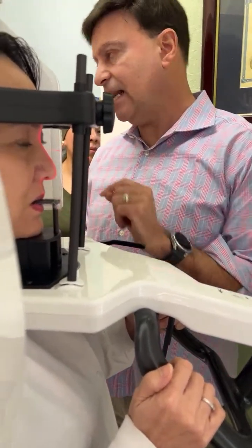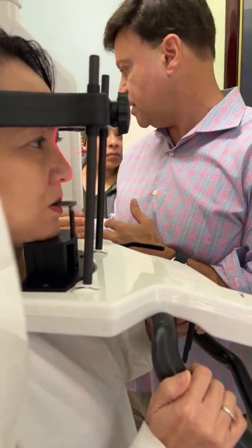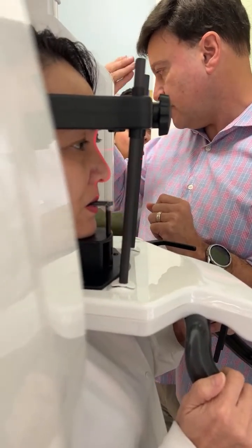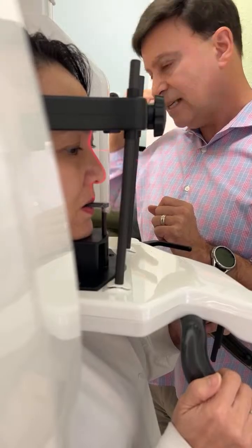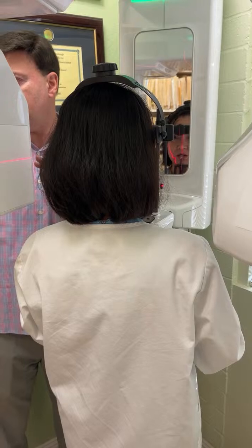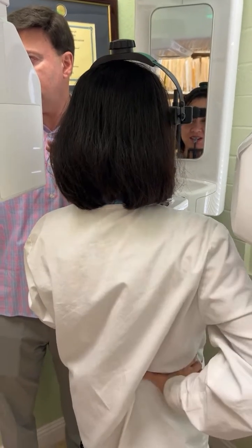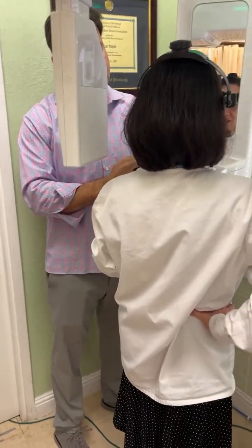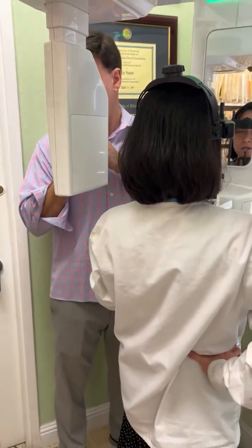You don't have to worry about this canine light because it automatically adjusts and takes the image that's most in focus. There's 5 slices, so you don't have to adjust this at all. It's just the mid-sagittal and the Frankfurt. That's the horizontal line across the face here, usually from the tragus here to the floor of the orbit. I don't always look at that. I just look at her profile. That's all I care about. I know if her chin is back or too far forward, I'm not going to get the desired results, or straight up and down. I'm just wanting her to come down just a little bit. That's the trickiest.